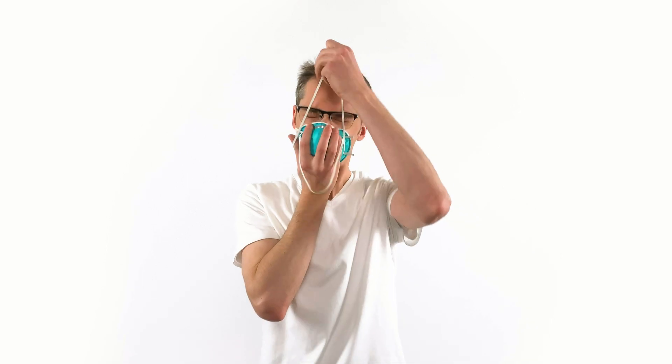Hold the N95 mask in the palm of your hand. To apply it, point its nose up and let the elastics dangle towards the floor. Place the mask on your face, pull the bottom strap around your head, and rest it below your ears.